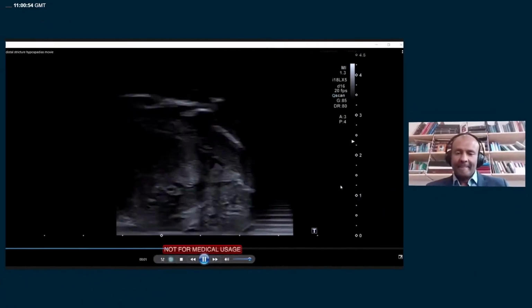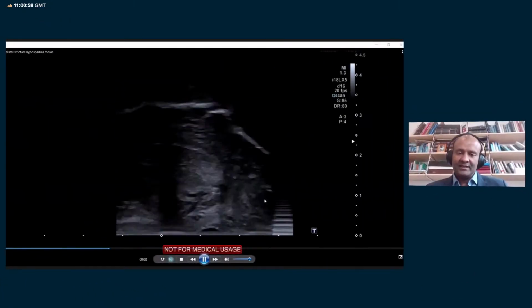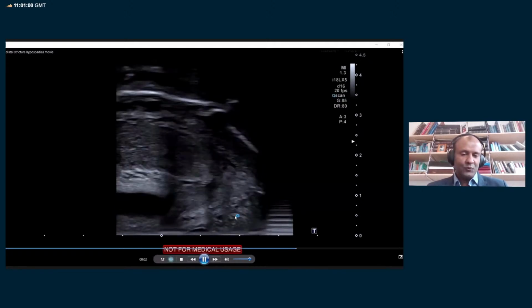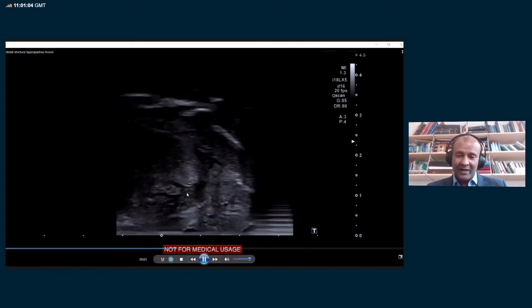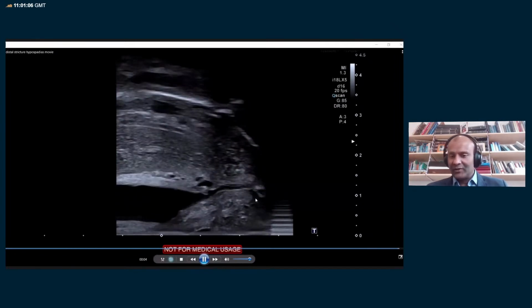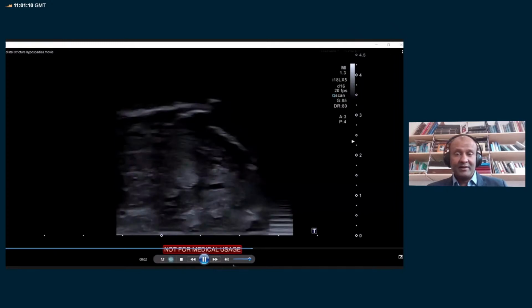And then I've got one final video to show you. And again, very similar. In this picture here, you can see how incredibly tight and narrow the lumen is. So this patient would have struggled quite markedly with symptoms because there's a very narrow distal urethra there. It would be sub 1 millimeter. So very narrow and very symptomatic.